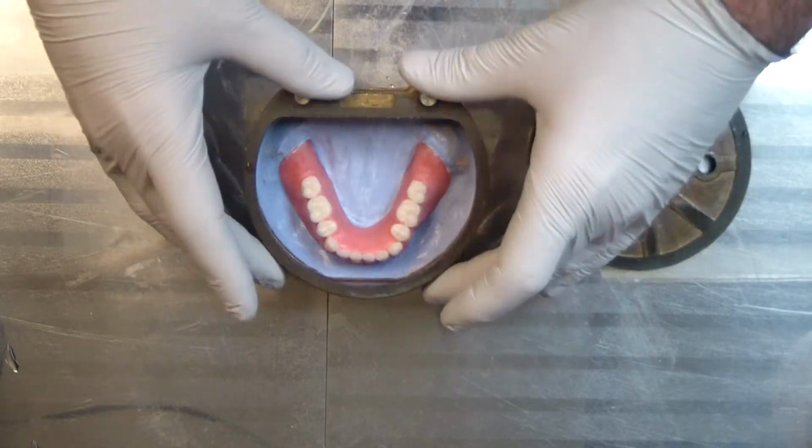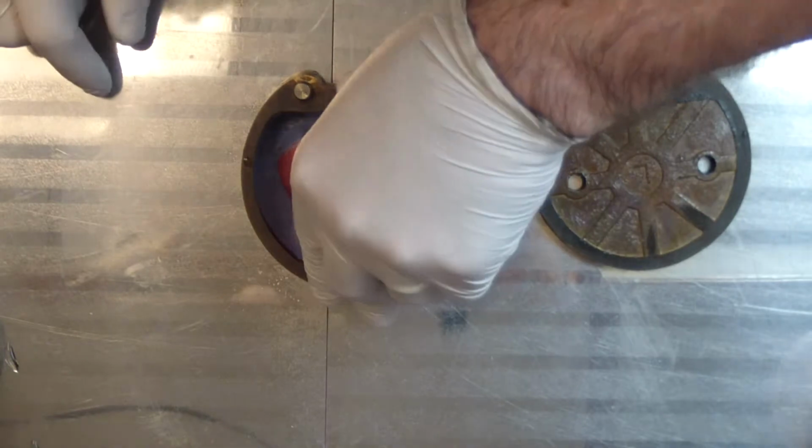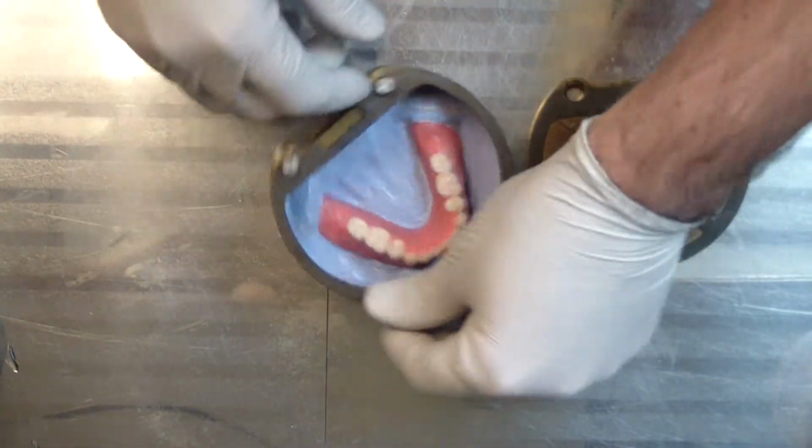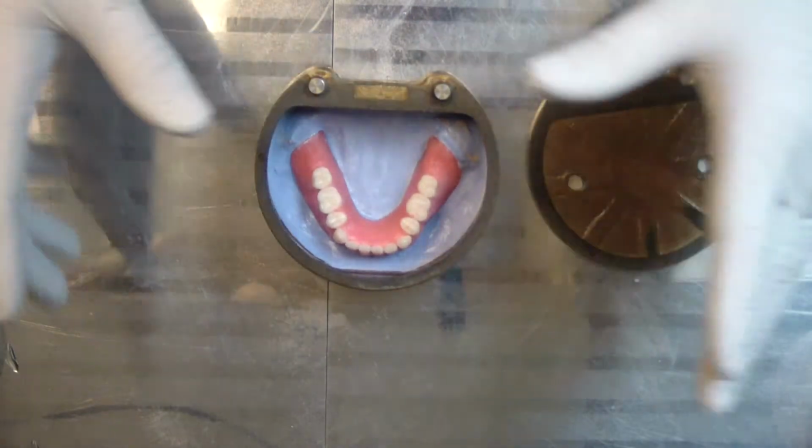So everything's lubricated, and then I place my second half of the flask. You want to make sure that it's fully seated all the way down. There's no kind of rocking or anything like that. You want to make sure your flasks are clean.